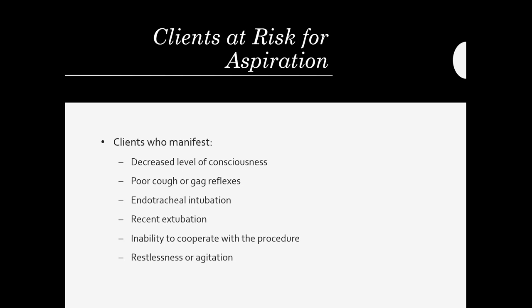Healthy individuals will usually cough and be able to get that out of their lungs. But we want to be careful since we are inserting this into the esophagus, which is right next to the trachea. We want to be careful not to cause any kind of aspiration due to this, and we want to be careful not to insert the tube into the lungs because that could cause respiratory distress.